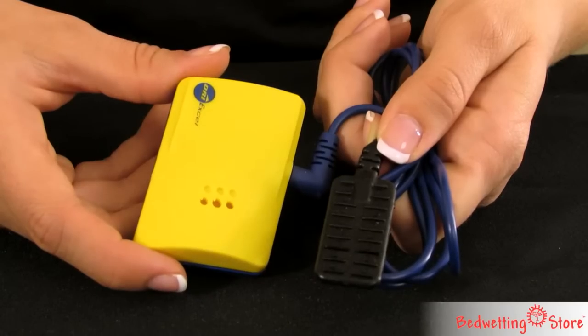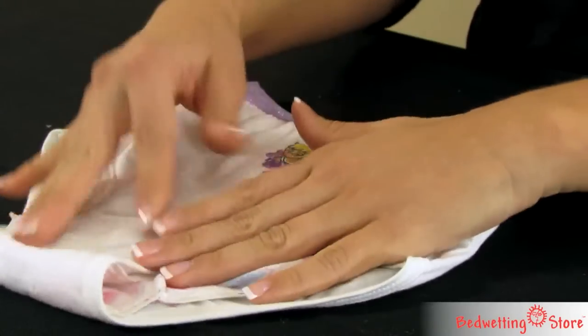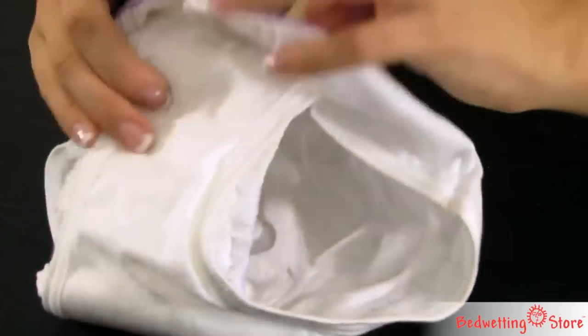The DryXL is an easy-to-use bedwetting alarm. The EuroSensor can be used to sandwich between two pairs of underwear, with a pull-up, or in a mini-pad.